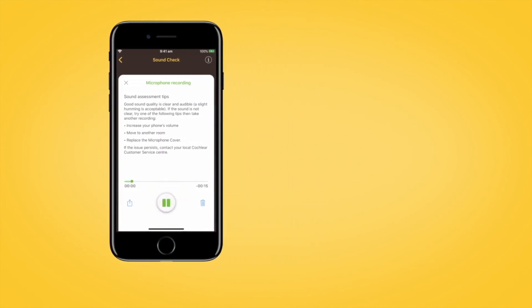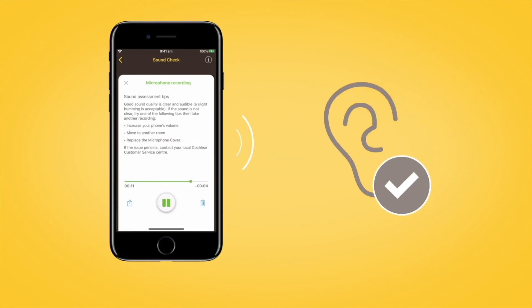Then tap the Play button to listen to your recording, and you will be able to assess the quality of the sound that the Kanso 2 sound processor microphones are receiving.